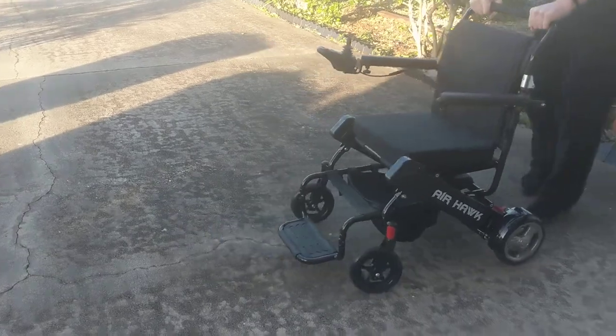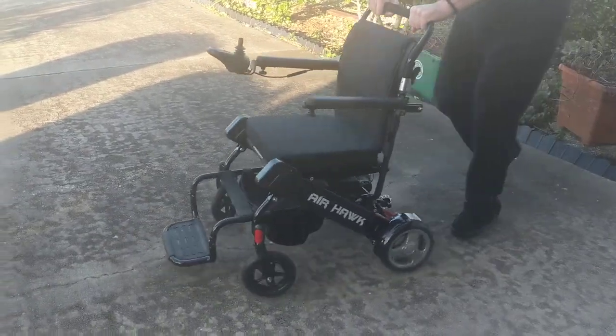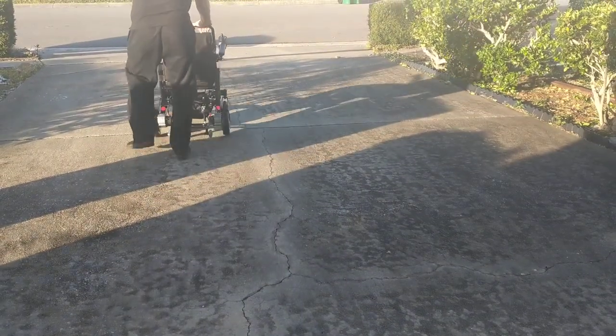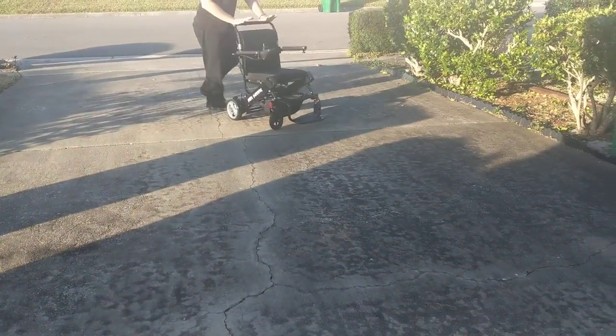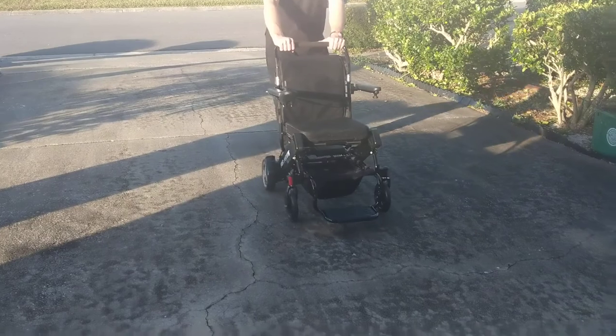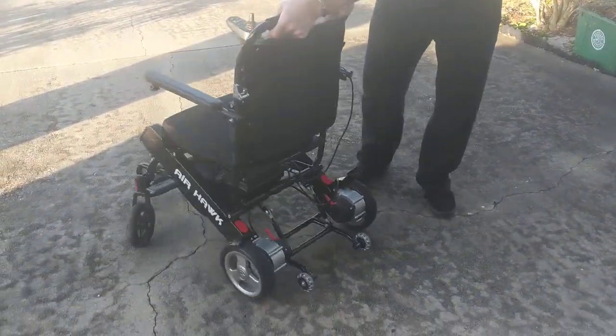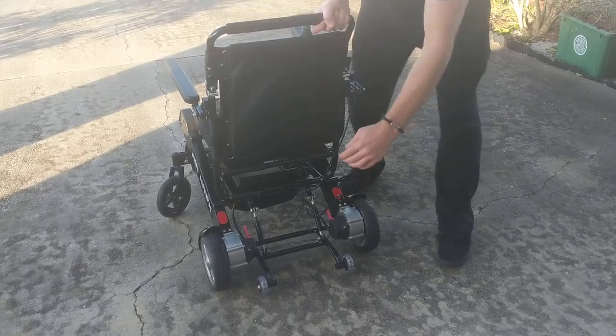If I was going to push the chair with somebody in it, it is very easy to push and very easy to maneuver. We're looking at the back of the chair.